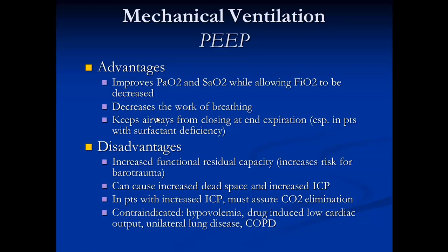Advantages of PEEP: improves oxygenation, decreases work of breathing, keeps the airway from collapsing. Disadvantage of that is that the higher you go in PEEP, the higher the risk of barotrauma. It could increase dead space and increases intracranial pressure, so you have to remember that for patients that have neurological damage. Do not start PEEP until the neurologist tells you otherwise. In patients with increased ICP, you must assure CO2 elimination first.